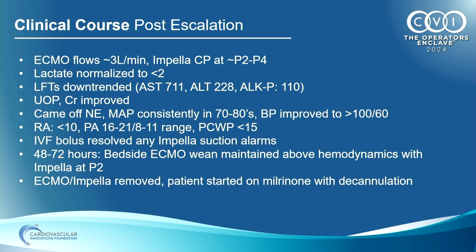At 48 to 72 hours, as mentioned, the pulsatility was improving, with very minimal to no support on the Impella. We did a bedside ECMO wean to see whether we'd be able to maintain appropriate hemodynamics with minimal to no support on the Impella. And I think at that point we saw that the filling pressures that I show here didn't really change that much on the wean, indicating that perhaps we're having some recovery here.